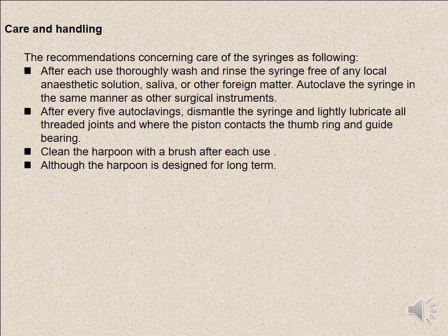How to care for and handle the dental syringe. The recommendations concerning care of the syringe are as follows. After each use, thoroughly wash and rinse the syringe free of any local anesthetic solution, saliva, or other foreign matter. Autoclave the syringe in the same manner as other surgical instruments.